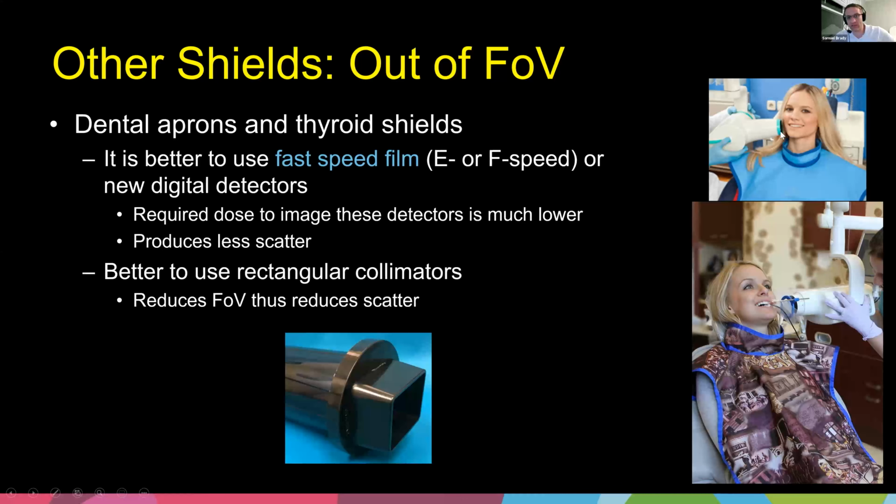Now I know you can see here in these images, there is no collimation. That's a circular collimator, a circular orifice. That is the vast majority of what we use today in intraoral dental imaging. That said, from the 1950s forward, the various dental organizations have been recommending longer PIDs, these position indicating cones, and square collimators. The film in dentistry is always rectangular. It's never circular. It's always rectangular.